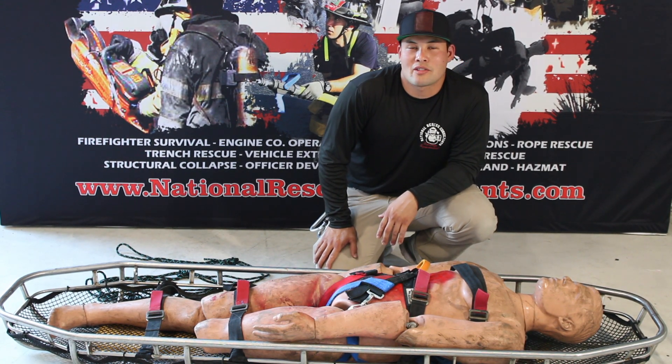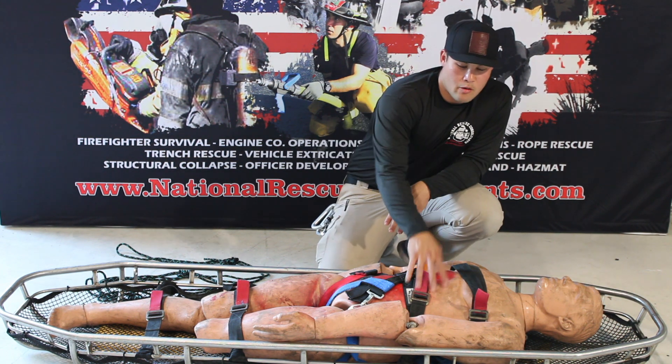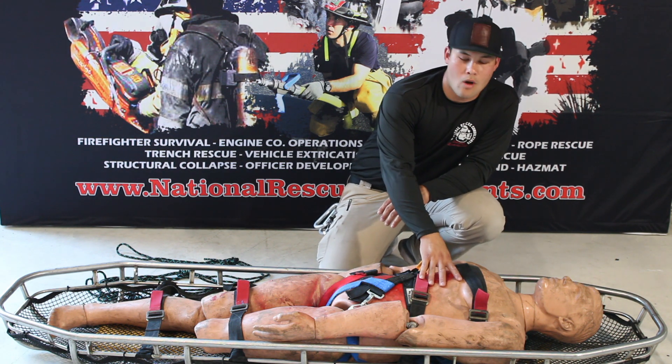Hey guys, Dave McCullough here with National Rescue Consultants with another installment of TRT Tech Rescue Tips. Today we're going to go over patient packaging — how we latch into the stokes basket here at NRC. We do it a little bit differently, so we're going to walk through it.